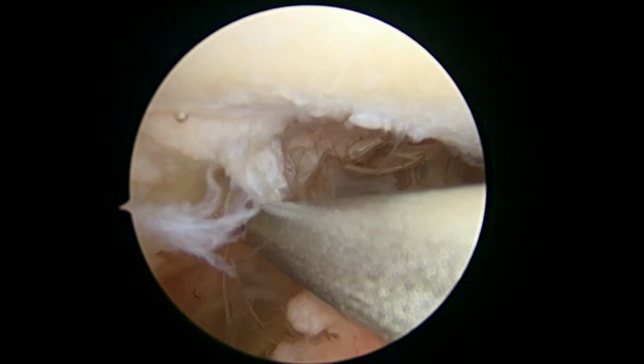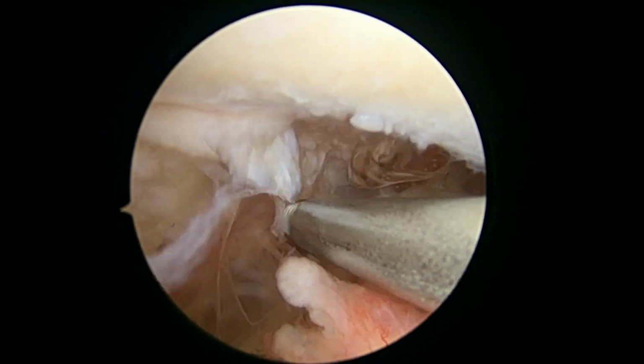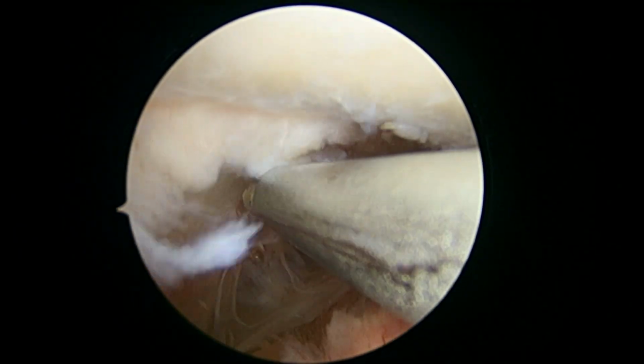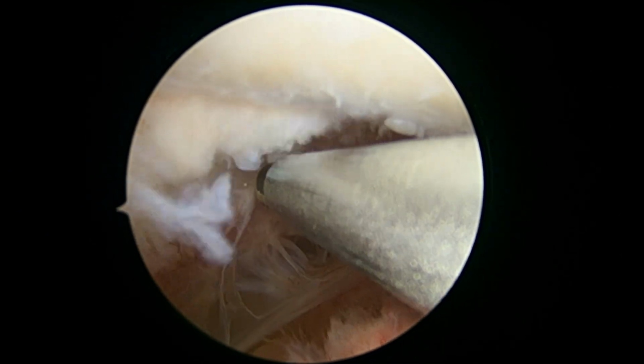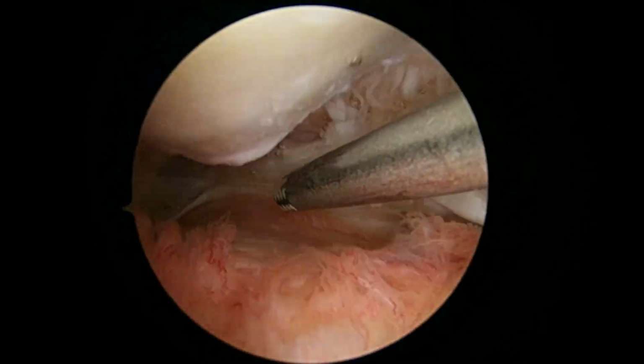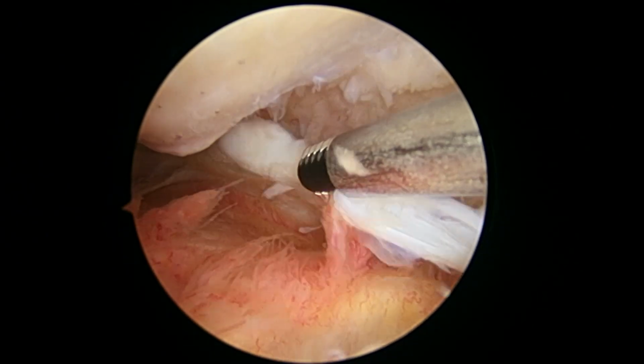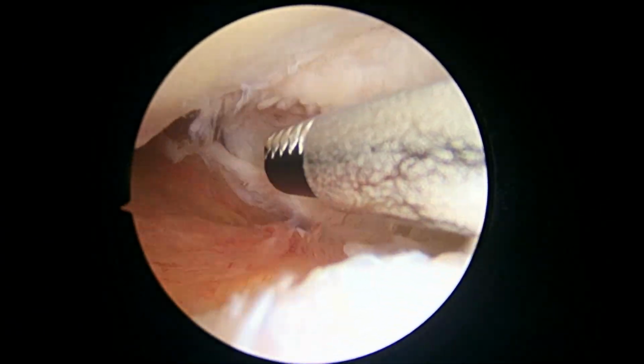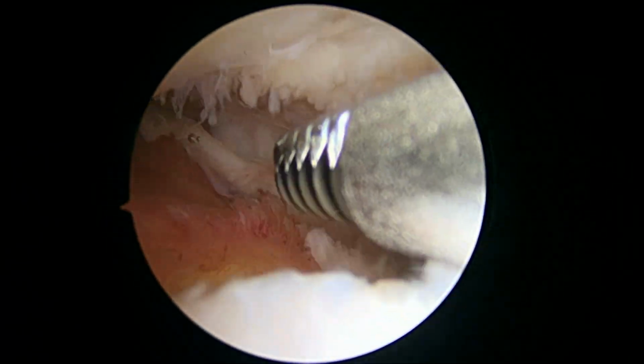Okay, so if there's anything else to show you, we'll come back up on the video, but I think for the most part we're done with the loose body removal and identifying exactly how much arthritis you've got. You basically got grade 4 arthritis in the patellofemoral joint, and I would say probably grade 3 in the lateral compartment, grade 2 in the medial compartment.